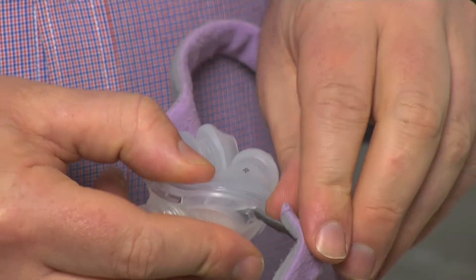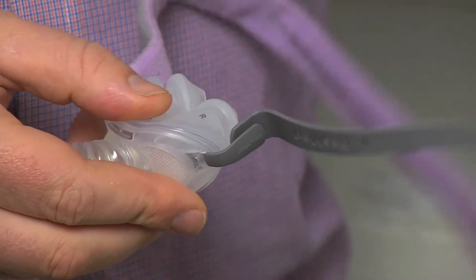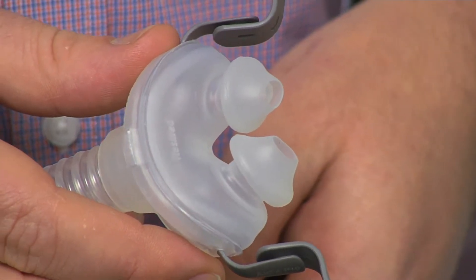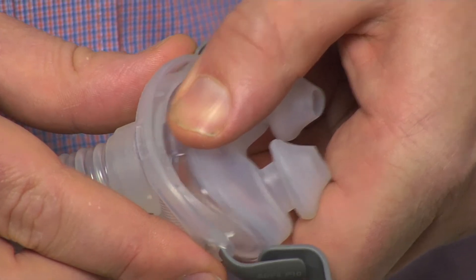The process for changing the headgear is quite easy. All you need to do is remove the headgear from the frame — it slides off with ease. This may now be a very good opportunity to give your mask a thorough clean. To take the pillow component of the mask out, simply unclip by squeezing together and pulling out.